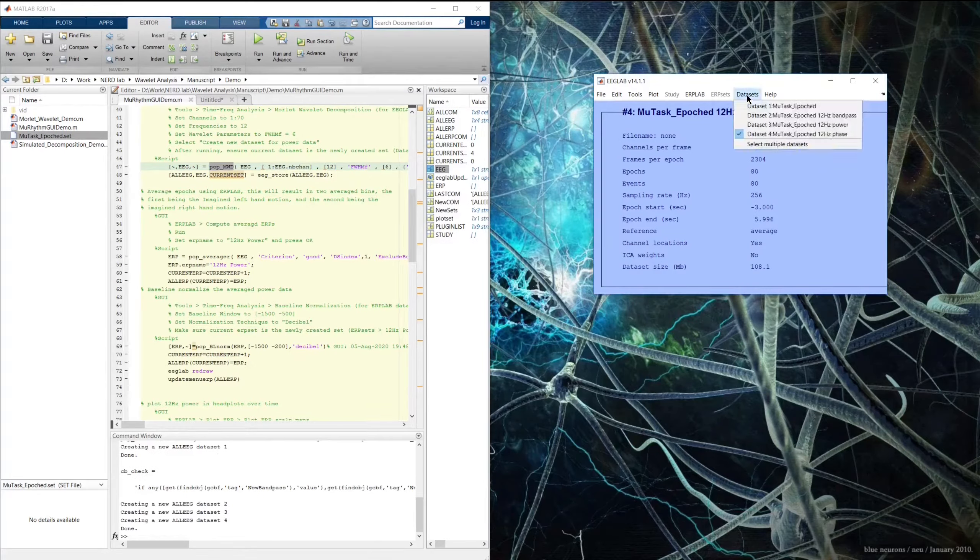Now we have a really good visualization of how the mu rhythm desynchronizes over time after an imagined motor movement. The top row is the imagined left-hand motor movement — starting at zero, about 500 to 1000 milliseconds in, we get a huge drop in mu rhythm over the right side sensory motor cortex that starts to taper off after about 3000 milliseconds when the trial ended. The same at the bottom for imagined right-hand movement — a large mu rhythm power drop over the left sensory motor cortex. All the functions called during this session are stored as equivalent command line function calls in the EEG and ERP structure history fields.